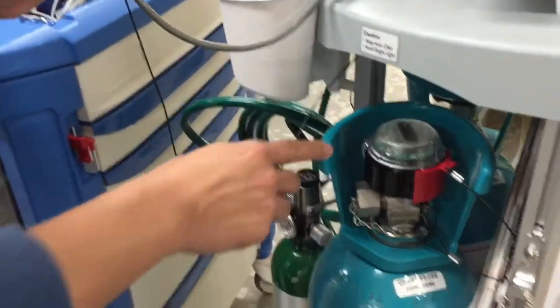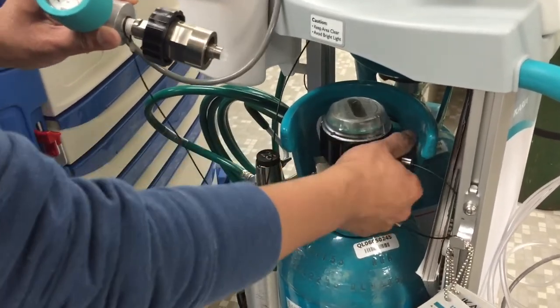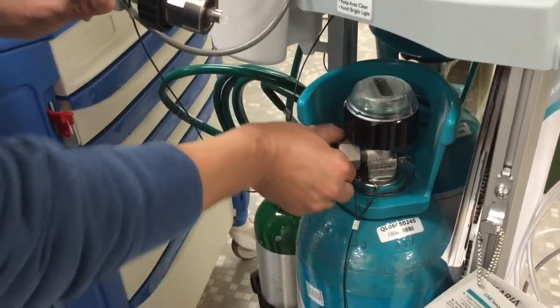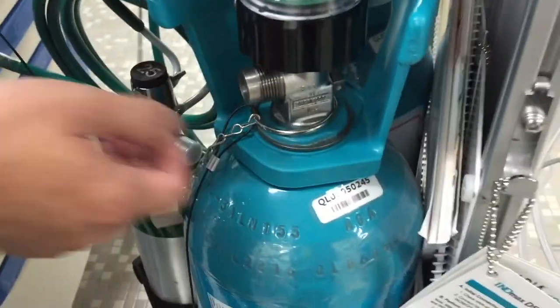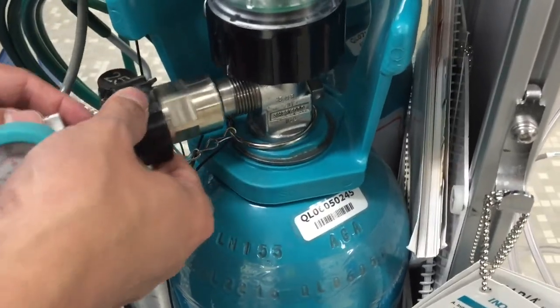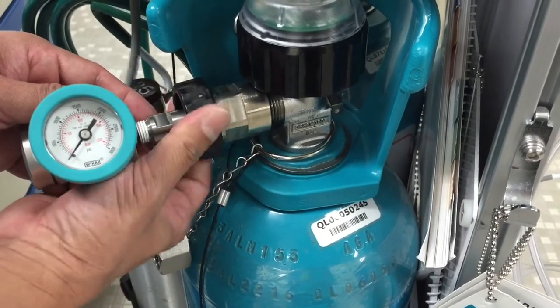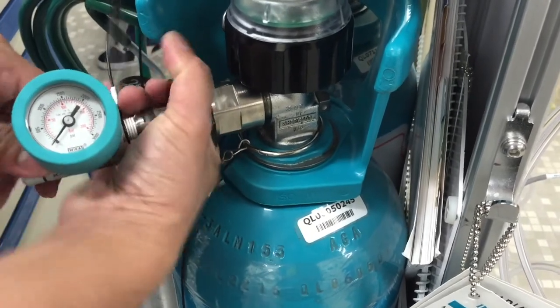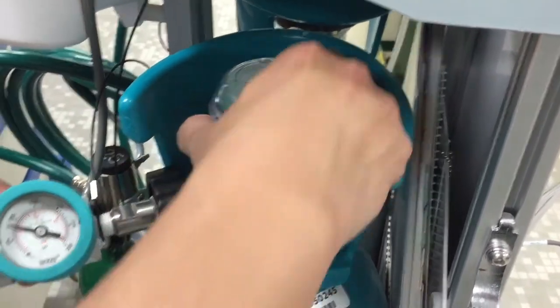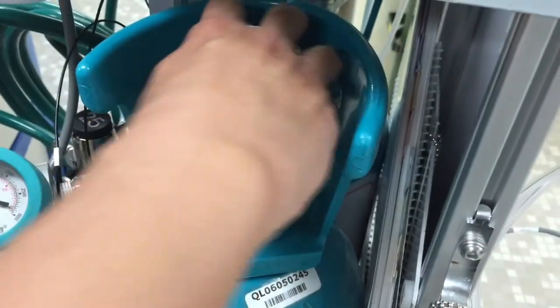Here's how the regulator gets connected to your tank. Your tank is right here — you'll pop the red lock off, unscrew the metal cap, insert your regulator, and screw it in. Then turn the tank on. You can see that it has that much pressure — and then just turn it off.